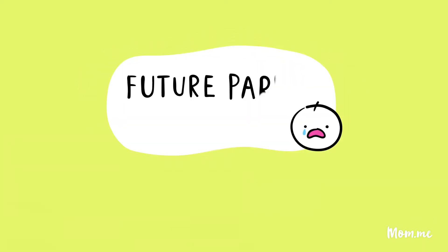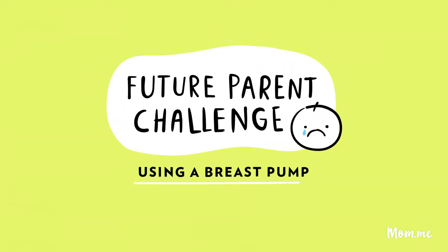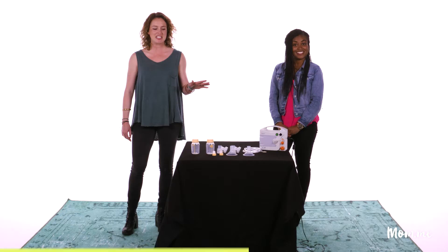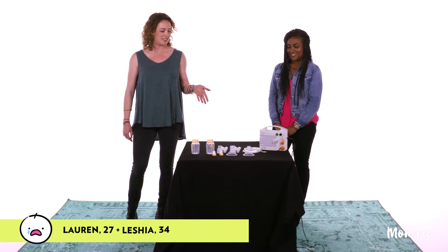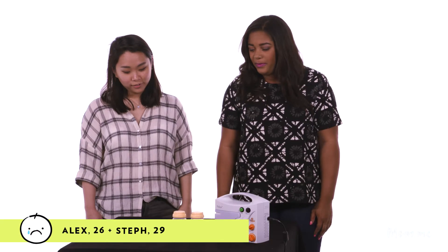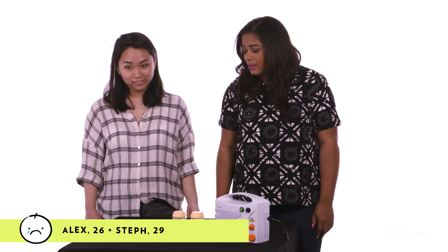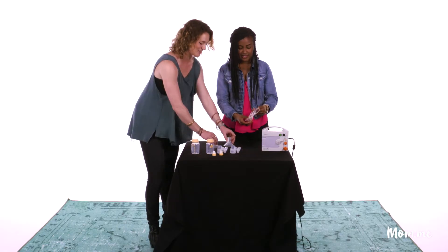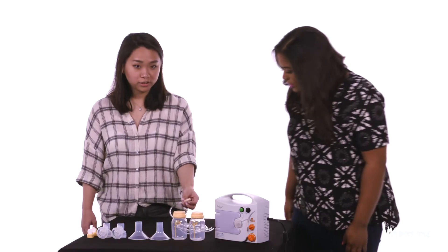We're gonna learn how to pump our breasts using this torture device that we have to assemble. I think this goes on your boobies over the areola — I can't even pronounce it. Does this go inside of you?